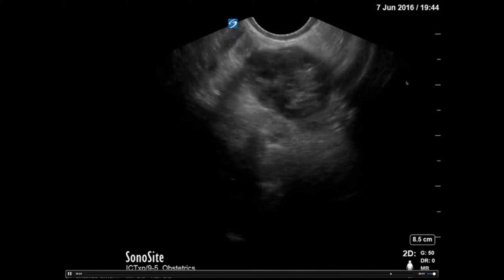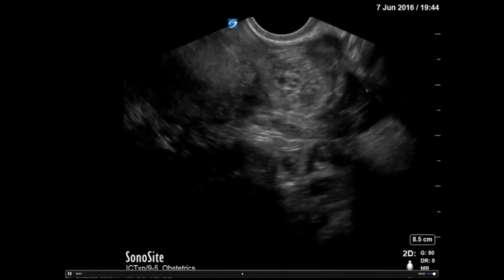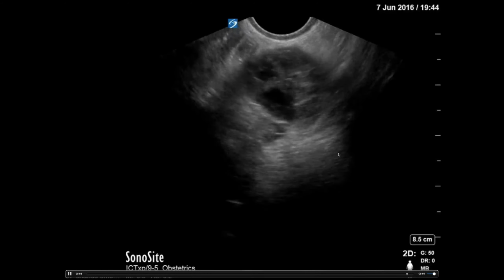Then we're going to see the iliacs on this side of the screen, like right here, and then they form basically a 45-degree angle. So once you've identified the iliacs over here and the uterus over here, this 45-degree angle is where the money's at. So just sweep up and down through that 45-degree angle, looking for tubal rings and other abnormalities.